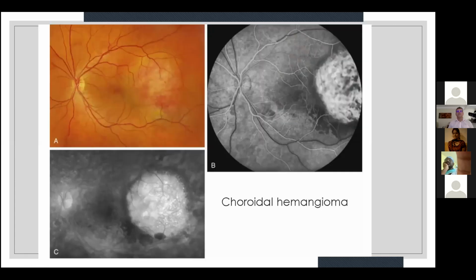This is a case of choroidal hemangioma. This is a fundus fluorescein angiography in the AV phase, as we can see the laminar flow, and we can see the hyperfluorescent choroidal hemangioma vessels depicting the new vessels, and there is increased fluorescent leakage by the end of the angiogram.